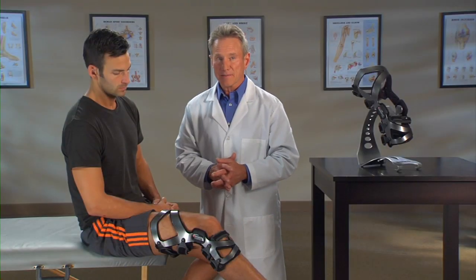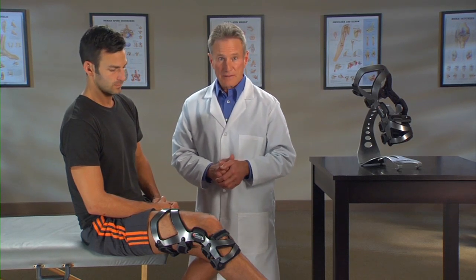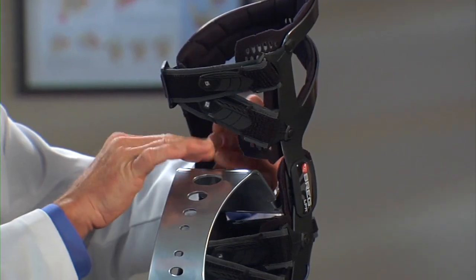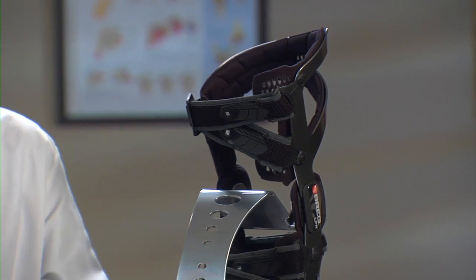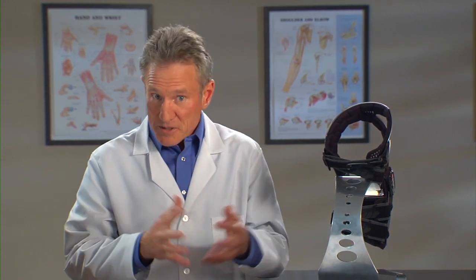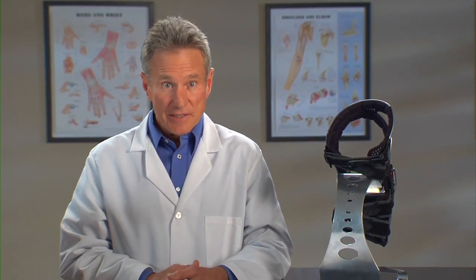Second, the brace works with your anatomy. See this large opening in the front? This is to accommodate your thigh muscle. LPR doesn't interfere with this major muscle so you're free to move unencumbered. See how the straps are crossed at the back of the knee, opening up this space here? Not only does this simplify strapping making the brace easier to put on, but it was also designed to keep the back of the knee clear. A lot of braces have straps or other brace elements that press on this area, making it difficult to get a deep bend at the knee. That can be a problem in many sports, maybe even activities you enjoy. LPR is different — there's nothing on the brace that puts pressure on this area, making it more comfortable without hindering motion, particularly in deep knee flexion.